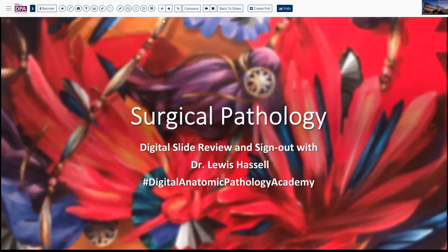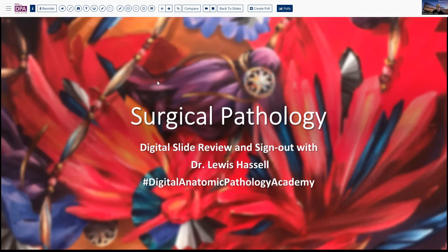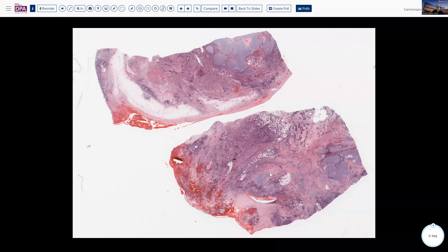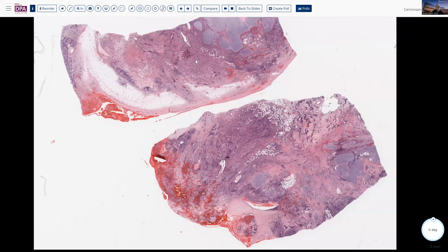Our program today grows out of a case that came up recently. As sometimes is the case, questions arise and you decide, well, maybe this would be something to talk about. So let me start with the slide here, rather than the history. And I think you can see at low magnification that this is a rather heterogeneous tissue.